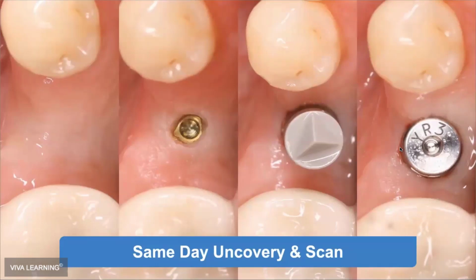You want to locate the center of the implant first to the best of your ability. There are a lot of different ways to do that. I often have a guide, so I just point down the middle of the guide and hit it bullseye every time. Once you uncover it, you place your scanning abutment on there, and then you can place a healer if you want.